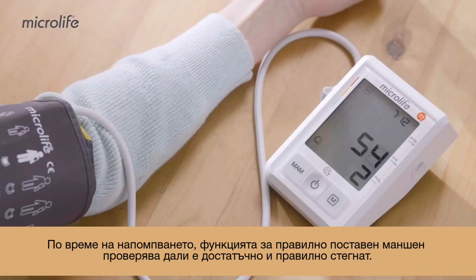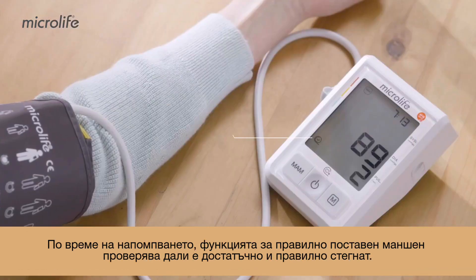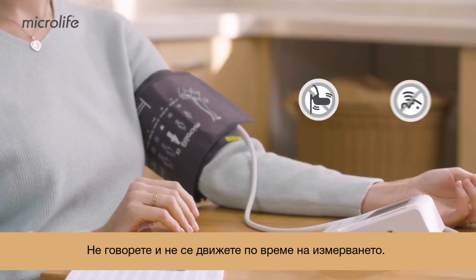During inflation, the Cuff Fit Check feature indicates whether the cuff fit is sufficiently tight or not. Refrain from talking and moving during measurement.